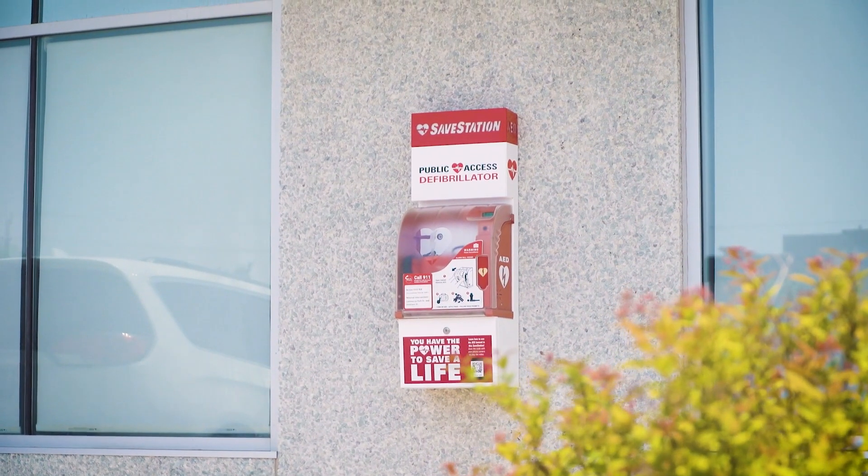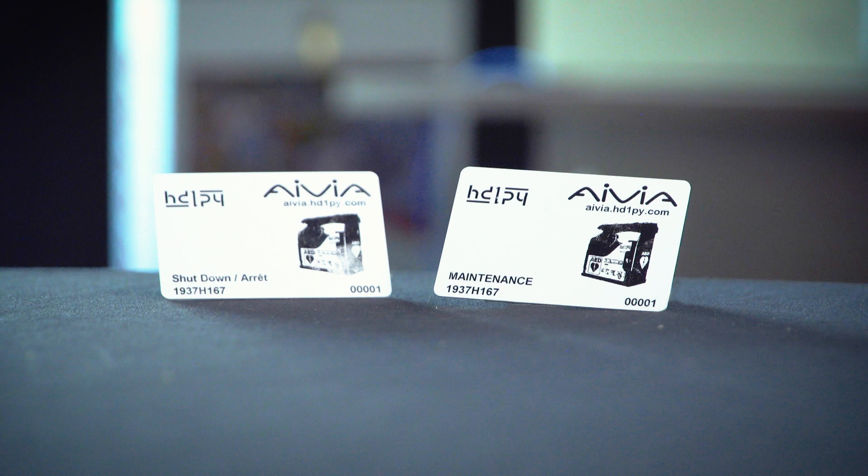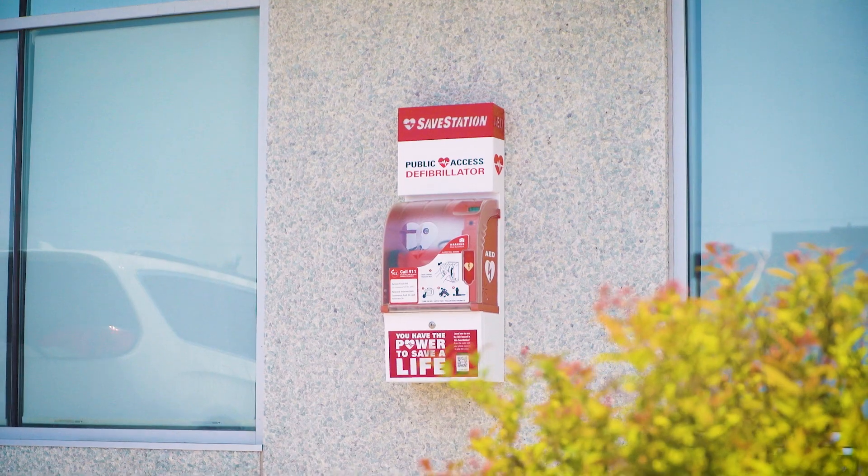This instructional video shows the proper use of the maintenance and shutdown cards you would have received with your monitored save station cabinet. If you are responsible for more than one monitored save station cabinet, you may have universal maintenance cards that will work for all of your cabinets.